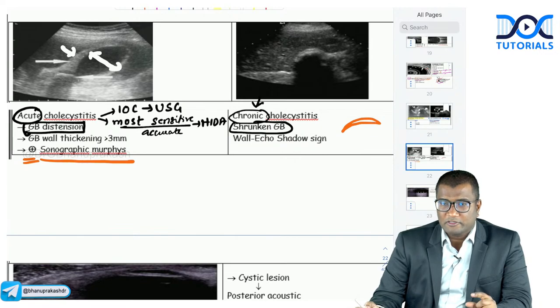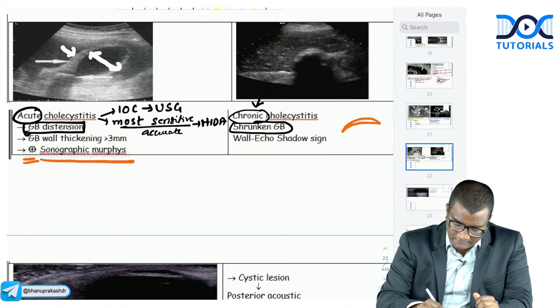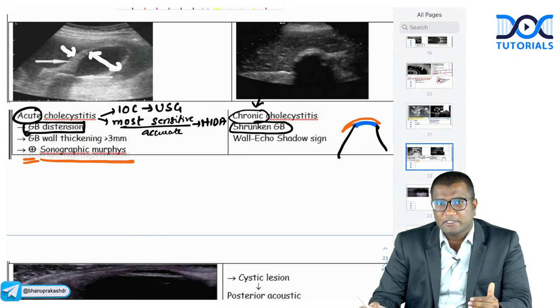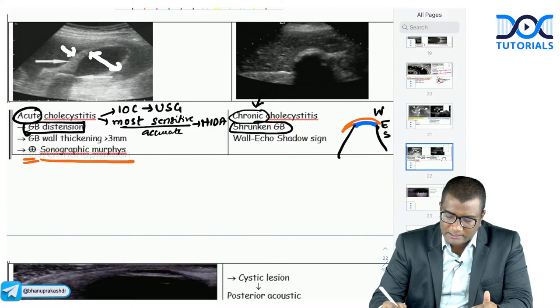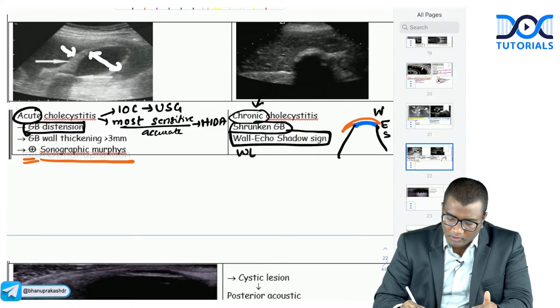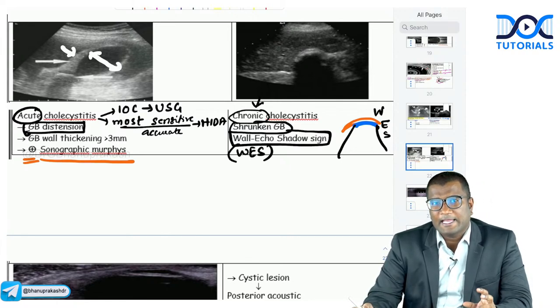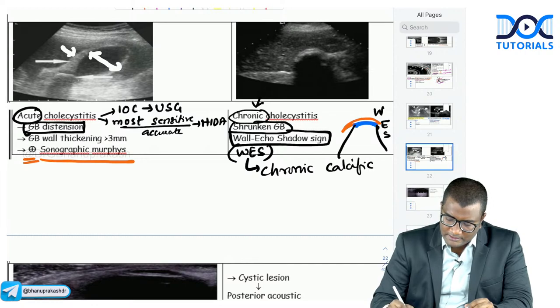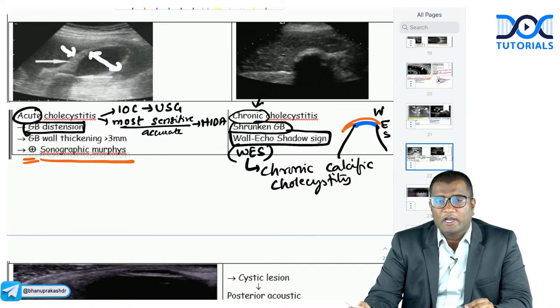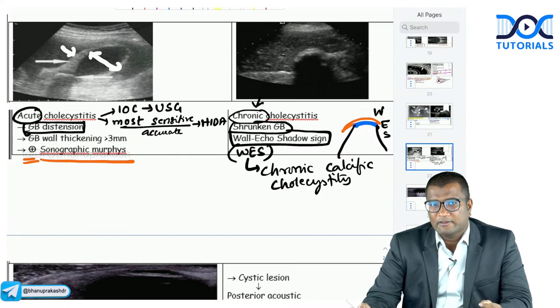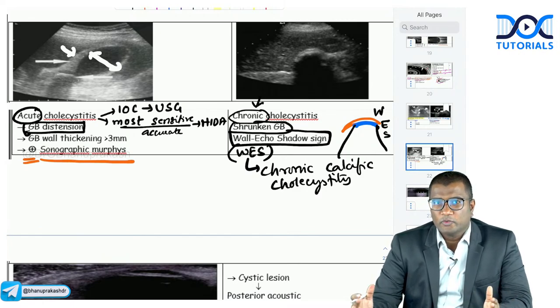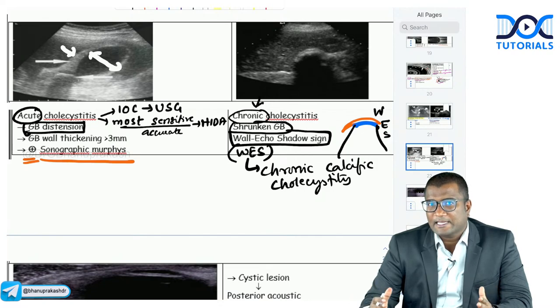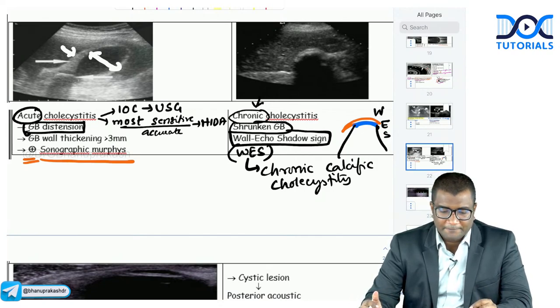In chronic calcific cholecystitis with a calculus, you see only the anterior wall, the echogenic (white) calculus, and the posterior acoustic shadow — you cannot see the posterior wall of the gallbladder. This is called the wall-echo-shadow sign or WES sign. It is characteristic of chronic calcific cholecystitis. In acute: distended GB with wall thickening. In chronic: shrunken GB with wall-echo-shadow sign.